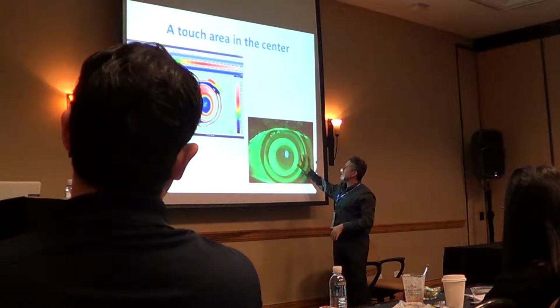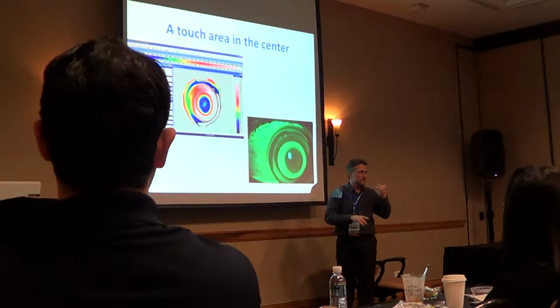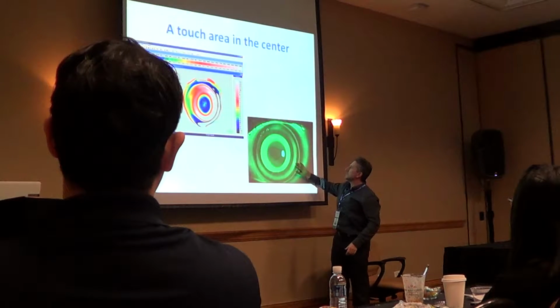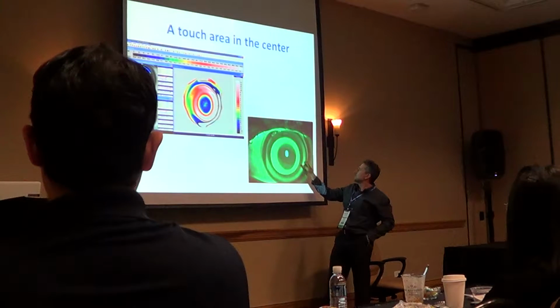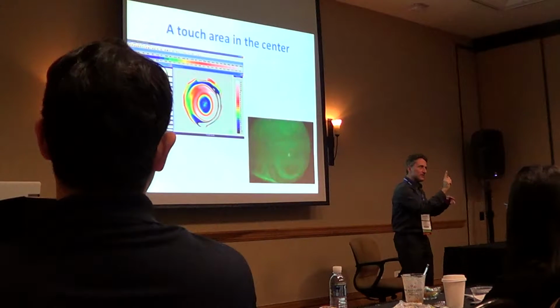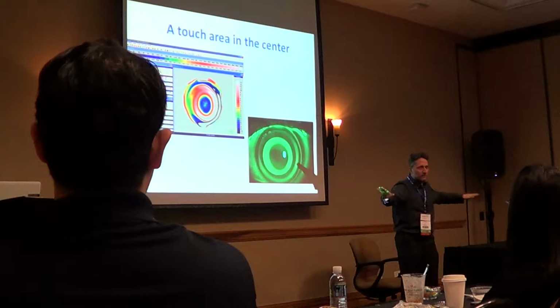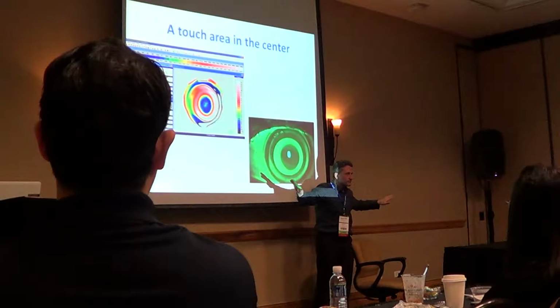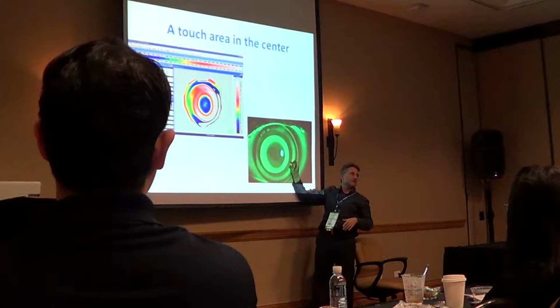So first assessment we have. Okay, let's go. First thing, central zone, touch. Alignment on nasal temporal is off. It is too steep here and too flat in the opposite. So why? Because the lens is moving. If we put the lens in the center, we will have equal peripheral edge lift. So the landing zone in this area and this area is too flat. Too flat because here is too steep and the opposite side is too flat.